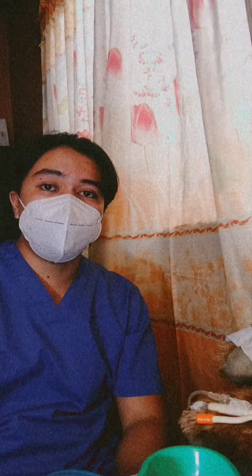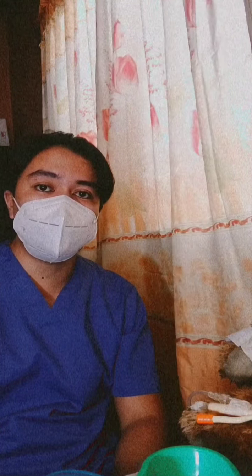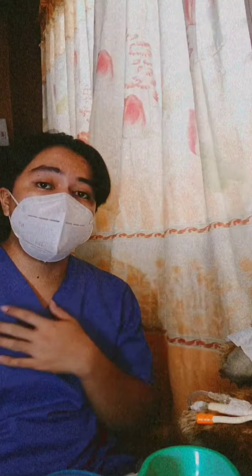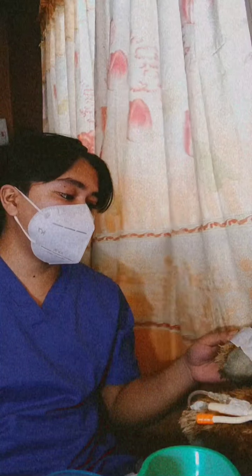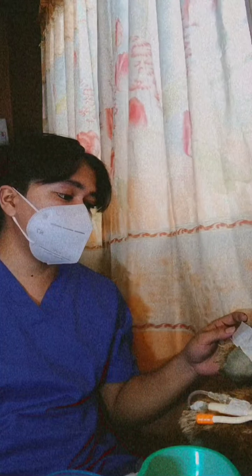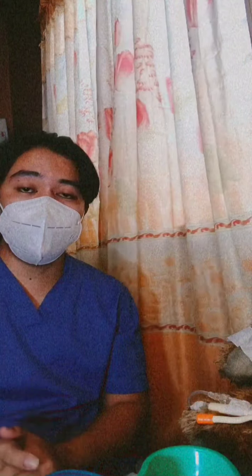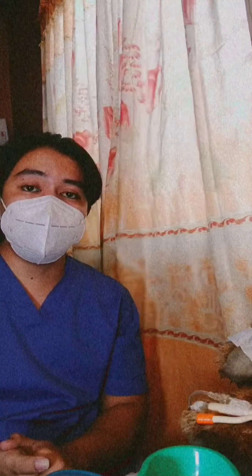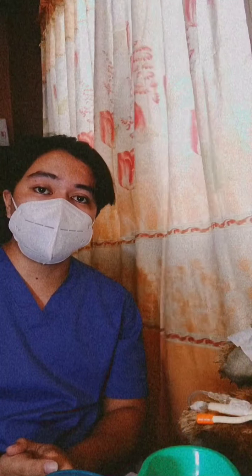Next, we need to review the patient's need for catheter irrigation in the patient's medical record, and then carry along to the bedside all the equipment needed, introduce ourselves to the patient, and verify the patient's identity. You are Mr. Teddy. Then wash hands, put on gloves, place the patient in a comfortable position, and place the bed in a comfortable working position.